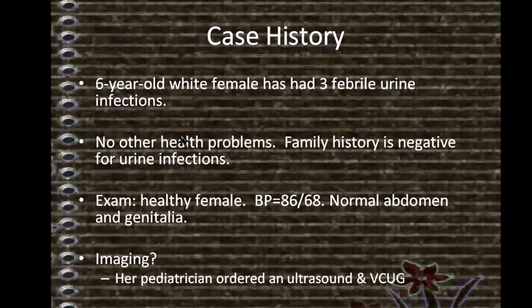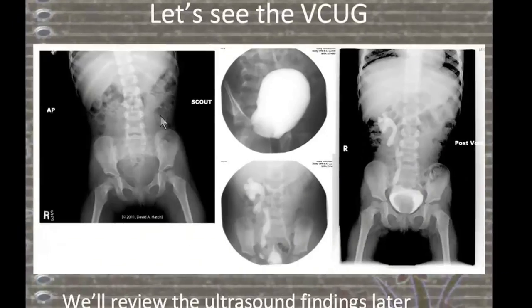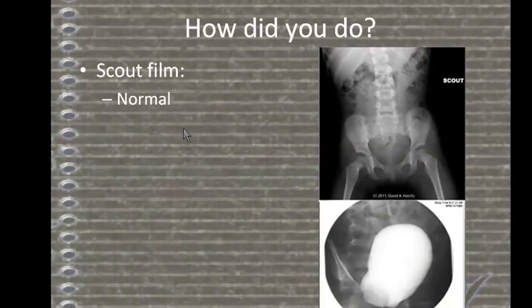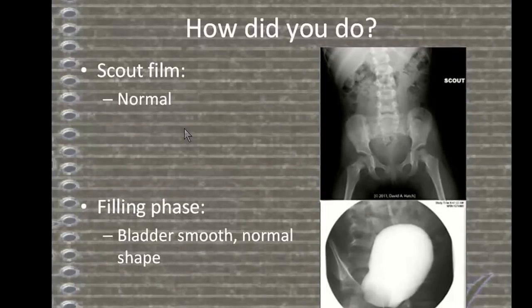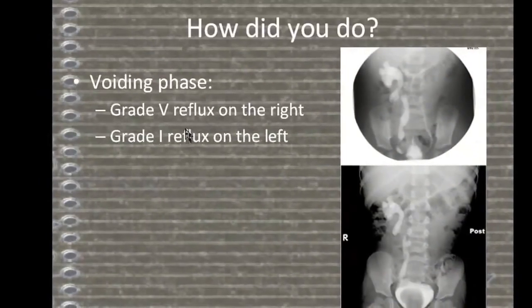Her pediatrician ordered an ultrasound and a VCUG. Scout film: normal. Filling phase: bladder smooth, normal shape. Voiding phase: grade V reflux on the right, grade I reflux on the left.